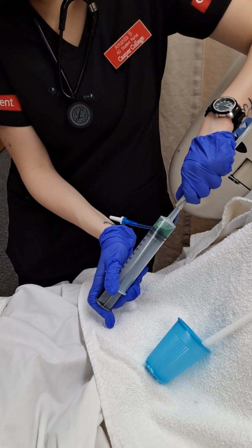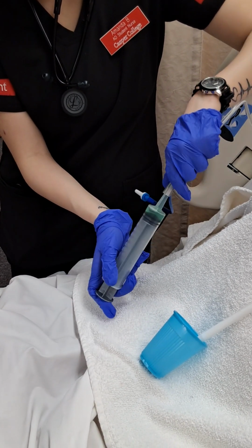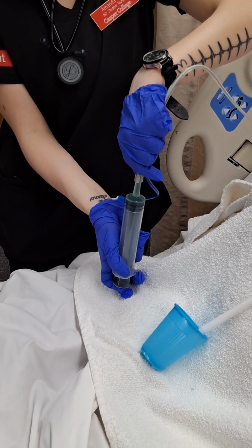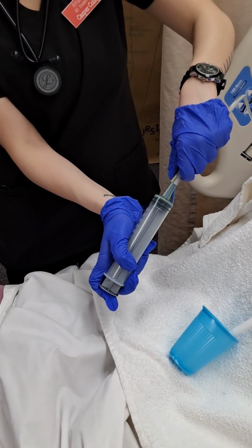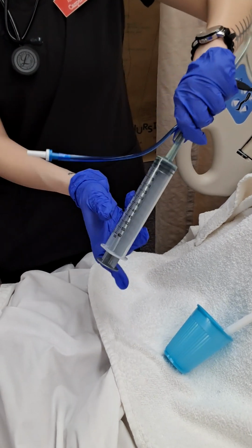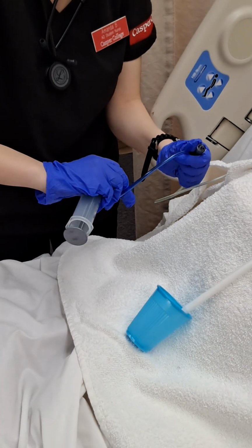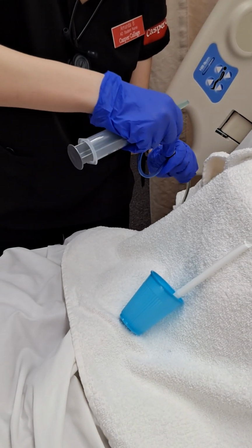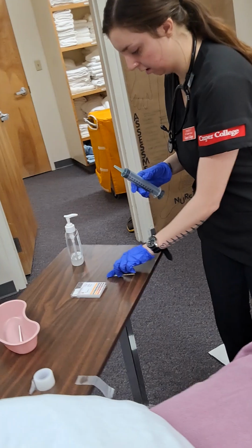I have around, not that much, so around like 2 mLs. That's enough. Okay. Now I'm going to do my pH testing.